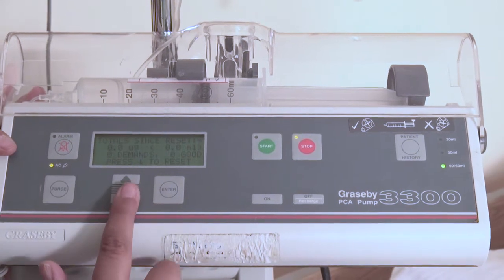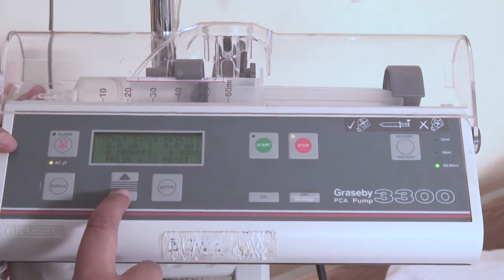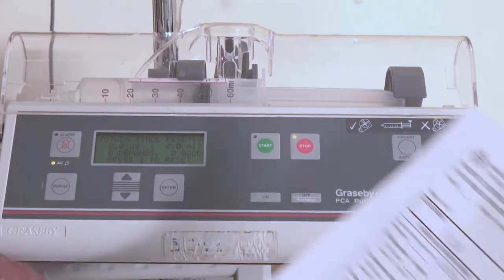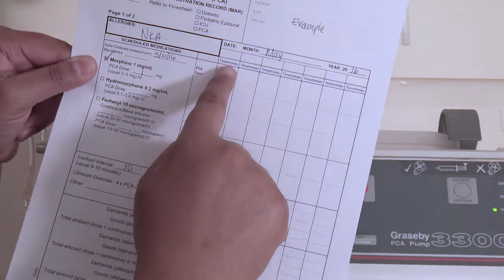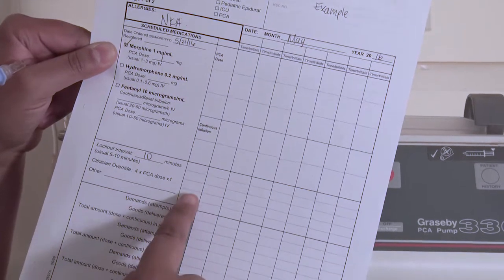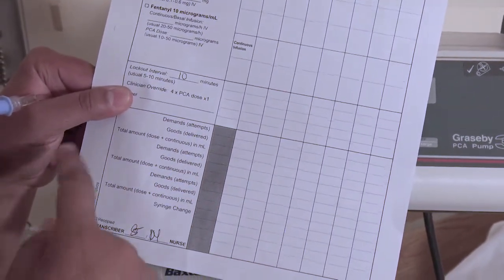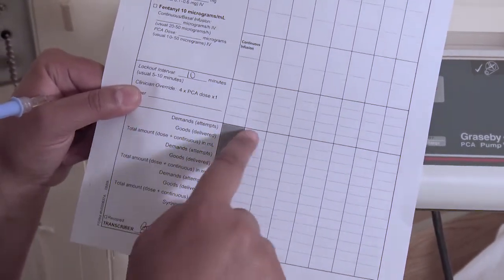When you want to clear it, usually check your policy, but you'll clear it once a shift. You would just press down and it would clear whatever is on here, and you would mark that down on your MAR. When you look at your MAR, you're going to be making sure that it's all according to here. You would be documenting your patient PCA dose, if there's a continuous infusion, what your lockout is, and then this is where you would document your goods and demands. How many goods did they receive and what are the demands? How many times did they attempt it? And then if they did have a continuous infusion, you would do some addition to calculate it.